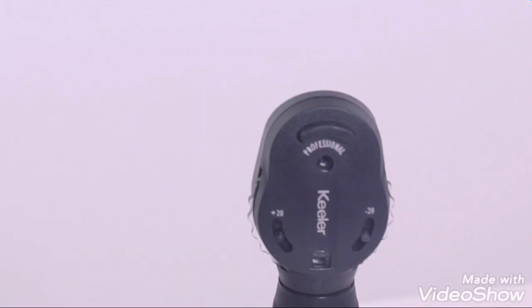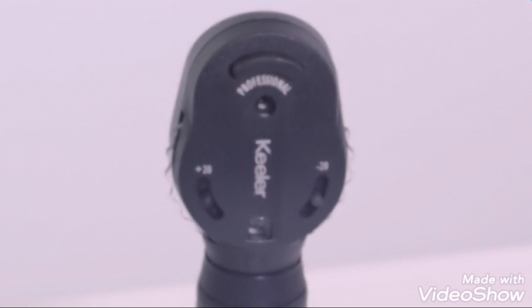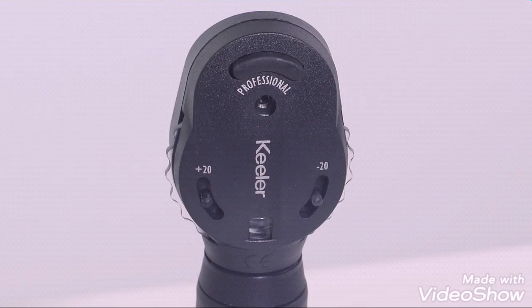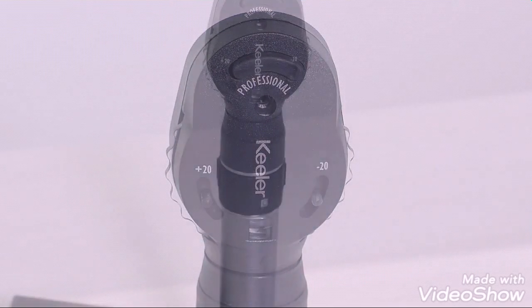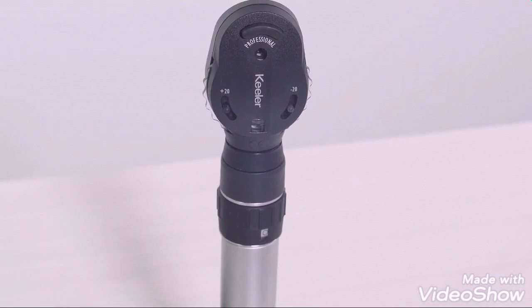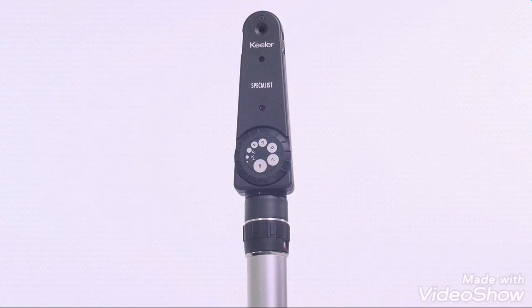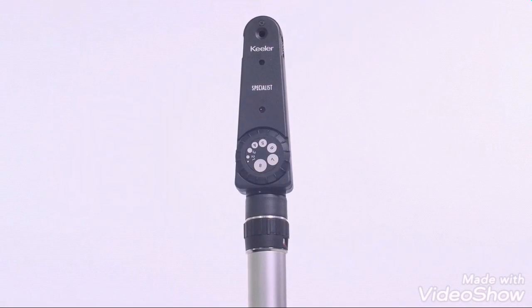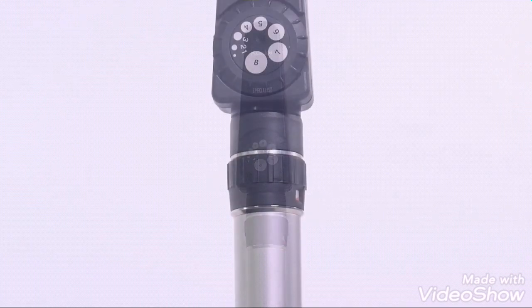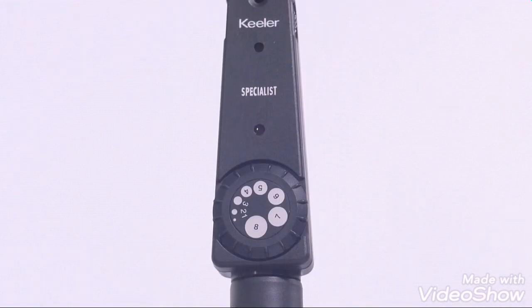The Keillor professional ophthalmoscope is designed to ensure ultimate control and fast examination. It features a comprehensive lens range from plus 29D to negative 30 and bright white xenon illumination. The Keillor specialist ophthalmoscope is the most precise and versatile ophthalmoscope, featuring individual ground glass lenses and additional features such as a pupilometer comparison disc.